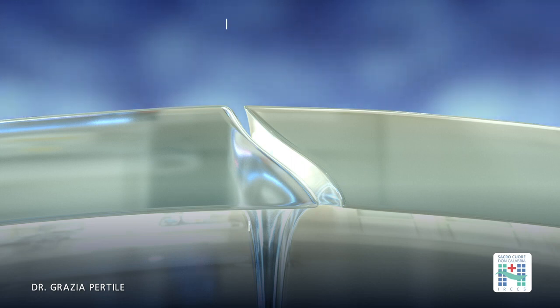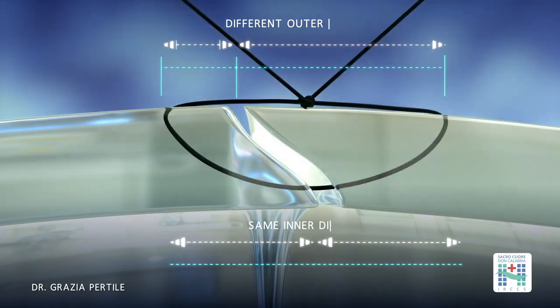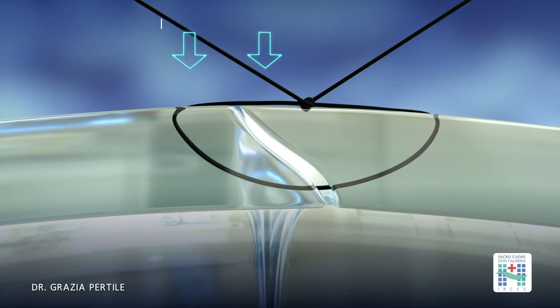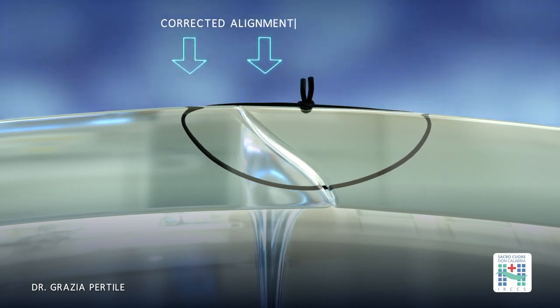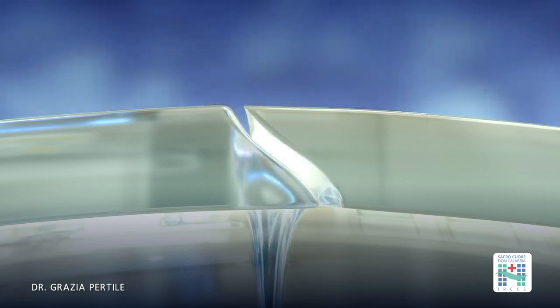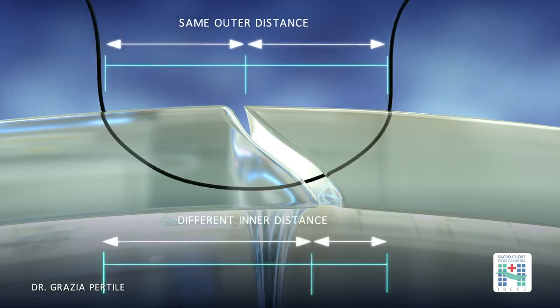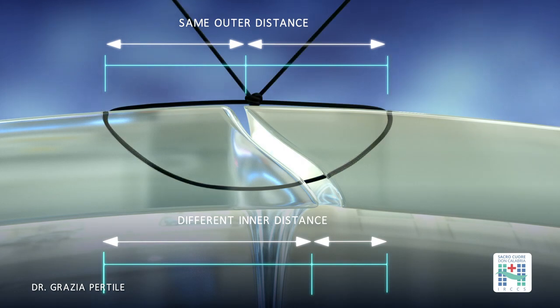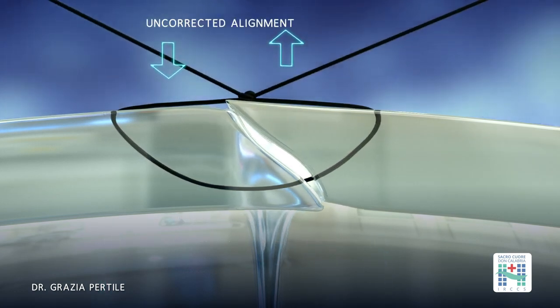When managing a shelved wound, it's essential to align the inner edges accurately, regardless of any asymmetry in the outer portion of the suture. In case of irregular corneal wounds, focusing on the symmetry of the sutures on the epithelial side rather than the endothelial side can increase the risk of wound edge overlap.